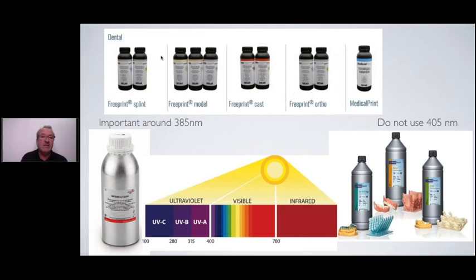And something interesting, these liquids we have here are very thick. That means you can hardly smell them. Other liquids, like you see here, the whole room smells. So you have a lot of free monomers floating in your room, and I don't think that's very good for your health. So personally, I would recommend some of these German liquids, which really seem to be also not an issue on the health situation like some other companies.